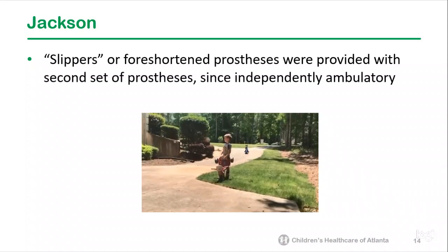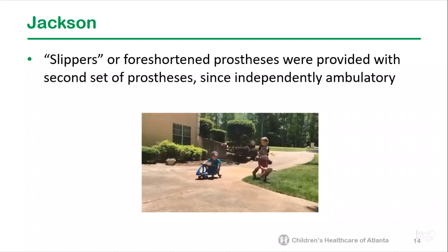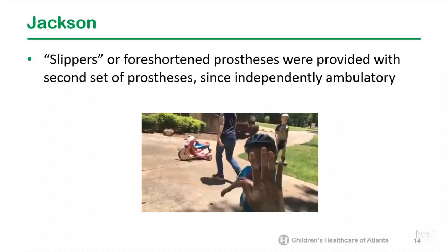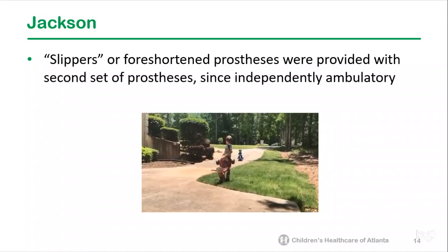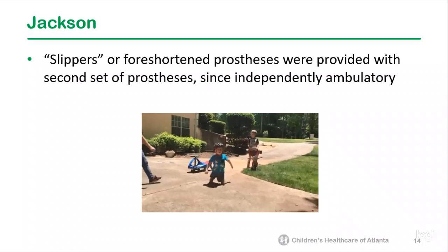Since Jackson was fully independent and his parents were requesting devices for playtime activities, he was provided with slippers or foreshortened prostheses. His mother reports that he currently prefers regular prostheses, but he does use his slippers for some things like riding his trike. Typically, we offer these foreshortened prostheses once they have mastered walking independently with their articulated knees.